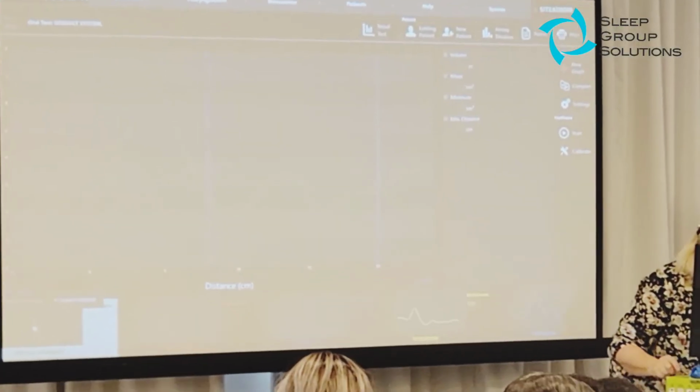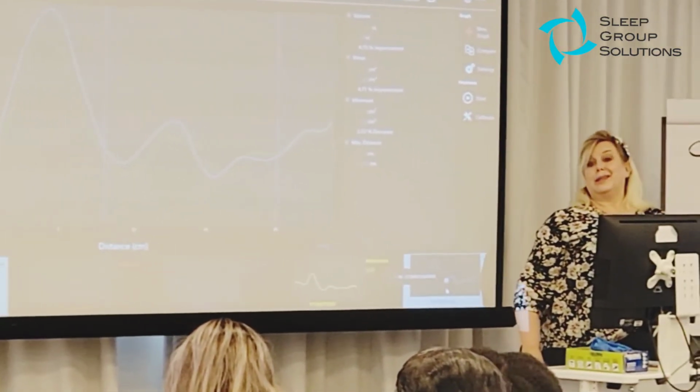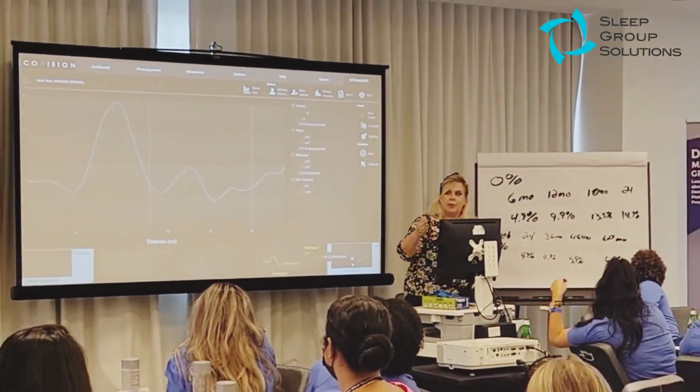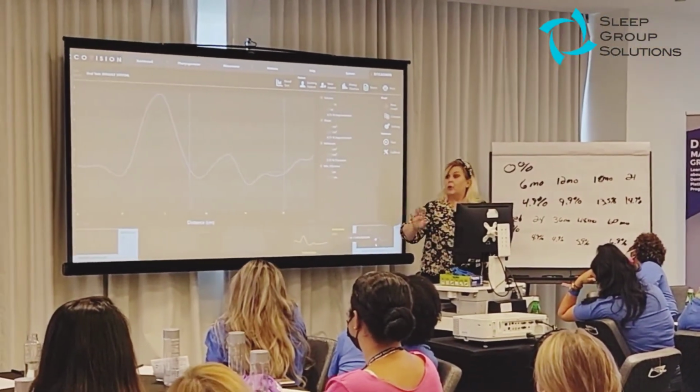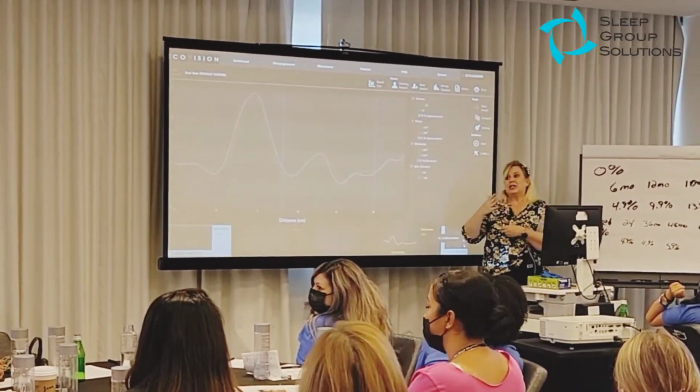Here's my normal airway. There's my airway at 10 millimeters vertical. Which do you reckon that's going to work? So that's the difference between being able to measure to take our bite rather than guess to take our bite. Now we know where we're going. Yes, ma'am? Were you able to feel the difference? 100%. You can actually breathe.